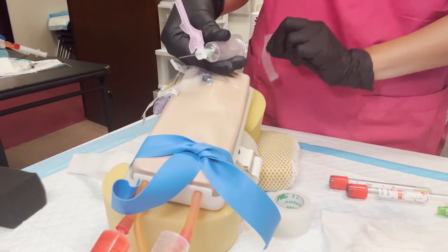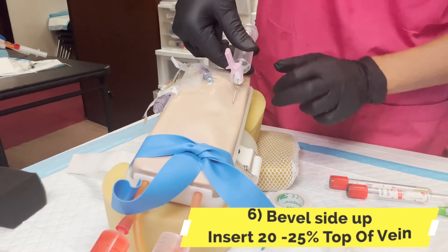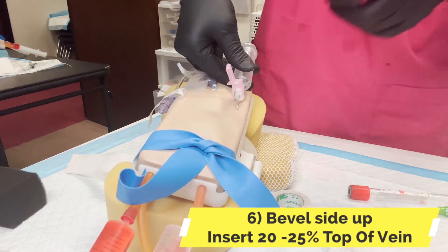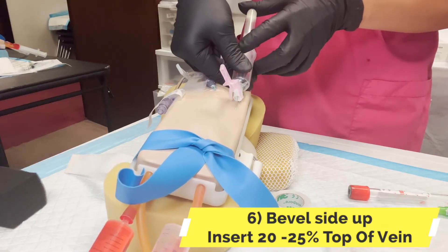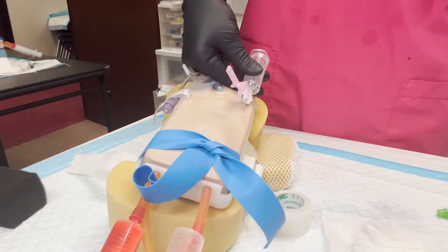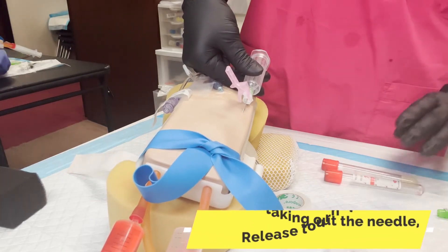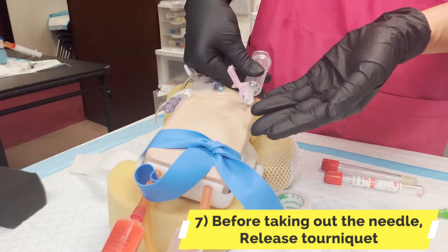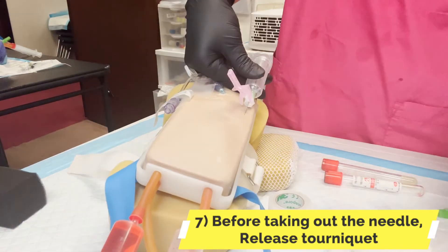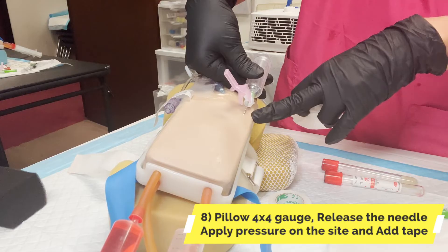Let's take off the green cap. Watch me first. If there's any tape that's disturbing you, it needs to go. We're going in at 20 to 30 degrees. You're going to grab and hold the tube — butt and two fingers. For the blood draw, as long as you are done with your tube, there should be markings there. Look at your tube — what's the minimum marking, how much blood you're going to collect. Before we take out the needle, two things: tourniquet off. But we don't want to put pressure on when the needle is in there because your patient will really not like you — it hurts.